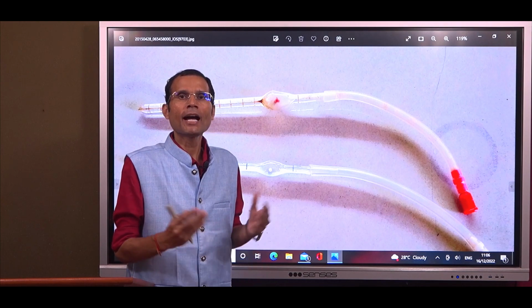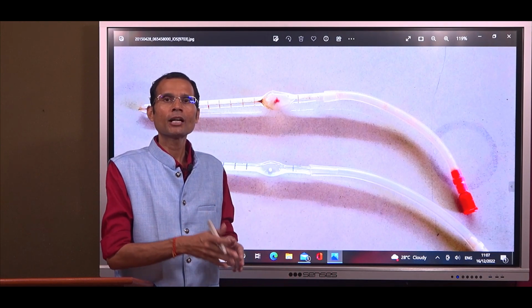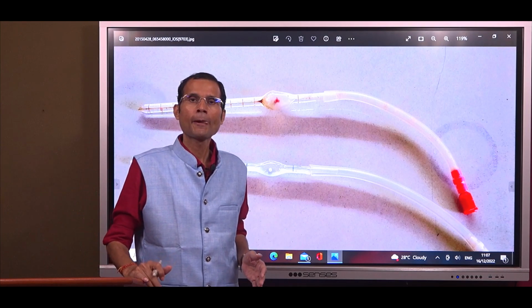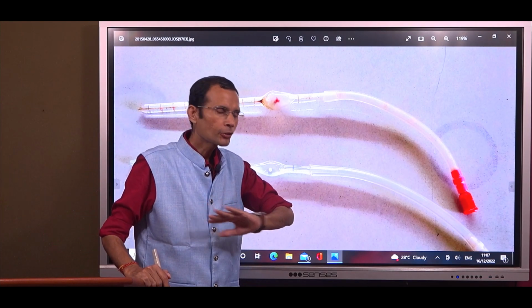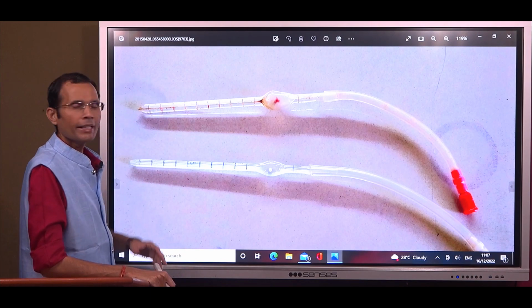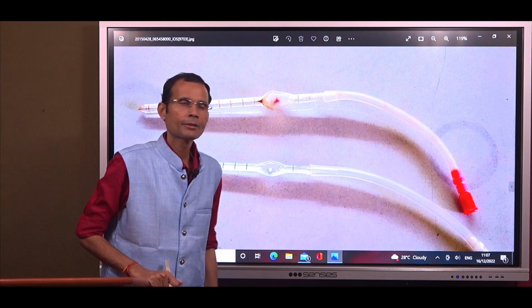This is simply dilution. I mean, one part of blood will be diluted up to 200 times. One part of blood will be diluted up to 20 times in the case of WBC. So, these numbers don't have any units, I mean to say. Any sample, any fluid can be diluted up to that extent.